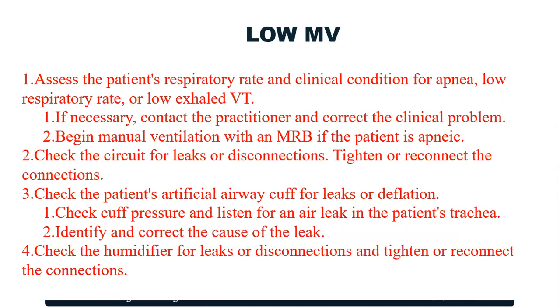Then the low minute volume. Assess the patient's respiratory rate and clinical condition for apnea, low respiratory rate, or low exhaled tidal volume. If necessary, contact the intensivist and correct the clinical problem. Begin manual ventilation if the patient is apneic.